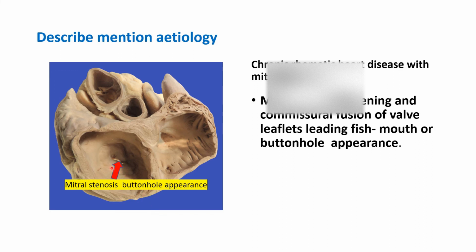Now in chronic cases sometimes you get this patch. What is that known as? MacCallum's patch. Chronic rheumatic heart disease with mitral stenosis.